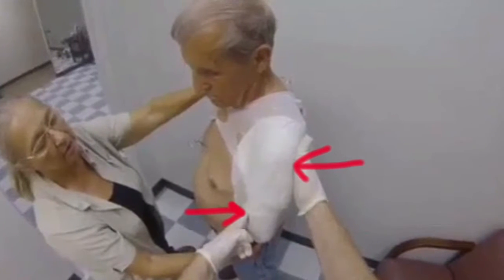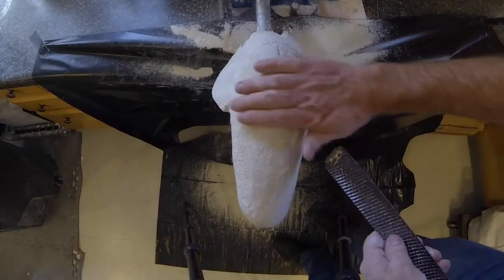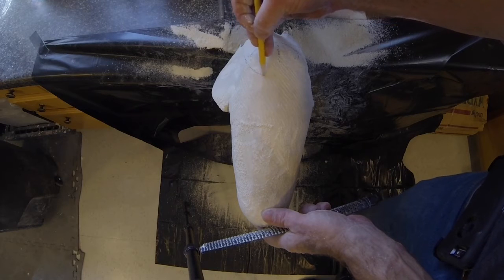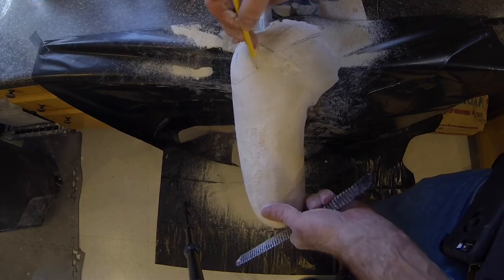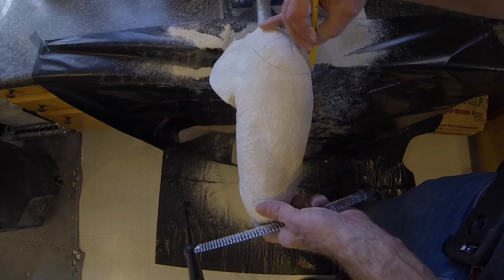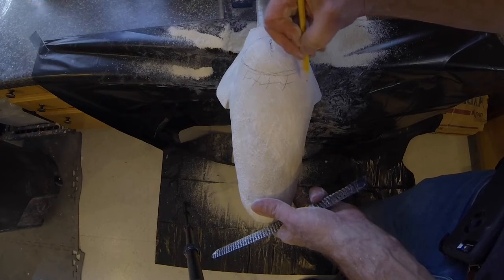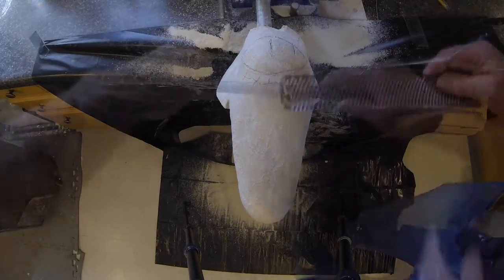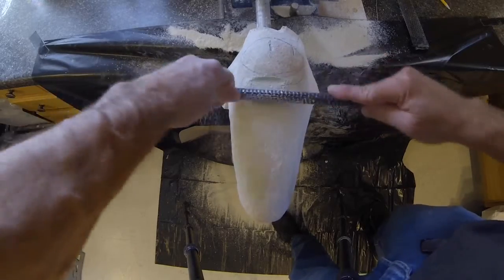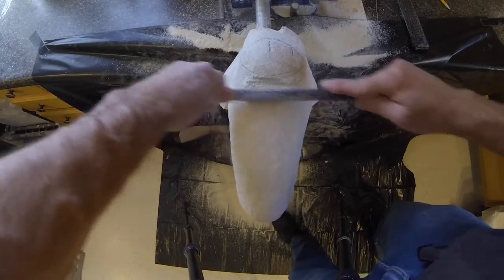During shoulder flexion the active force couple will be anterior distal and posterior proximal, as shown. This socket will be an open shoulder design. The trim line for the lateral wall is marked as shown. Using a round file, reduce this point about three-eighths of an inch. The amount of plaster removed depends on the size of the residual limb and the amount of soft tissue.